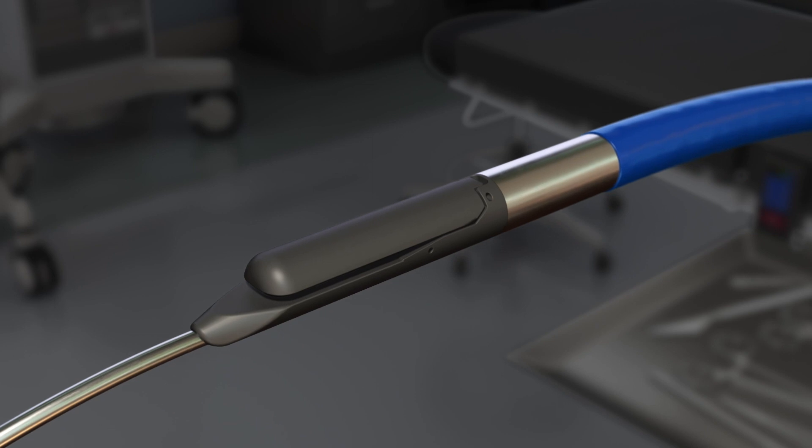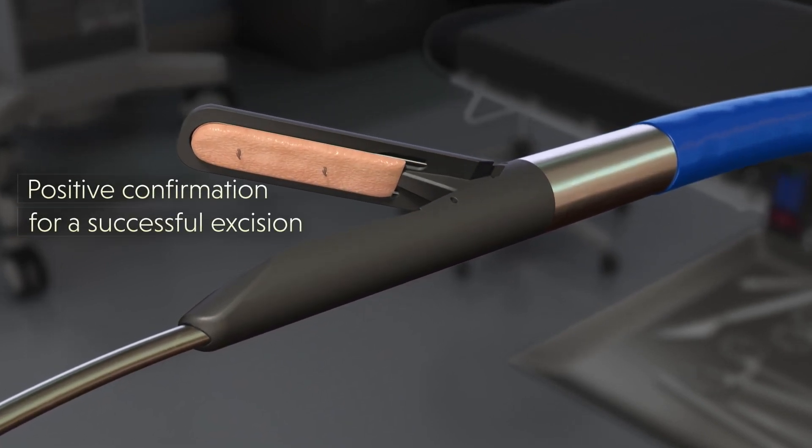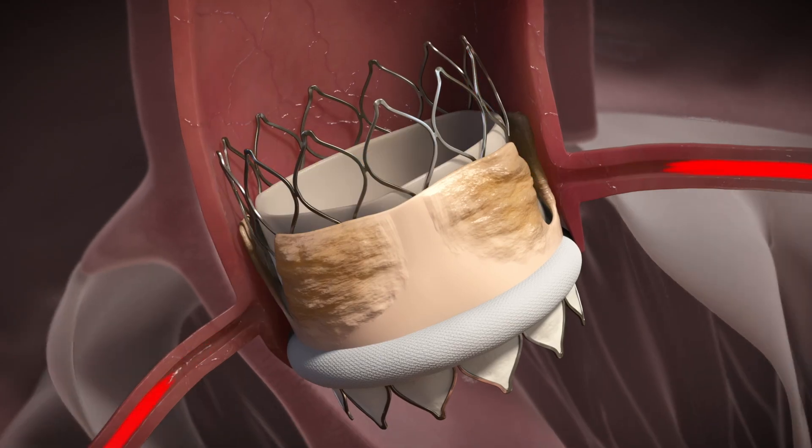Once evacuated from the body, the piece can be examined, thus providing positive confirmation for a successful excision.